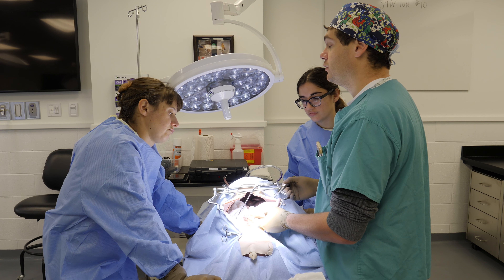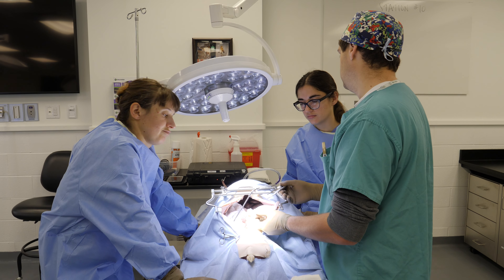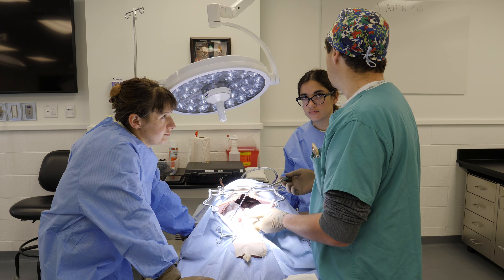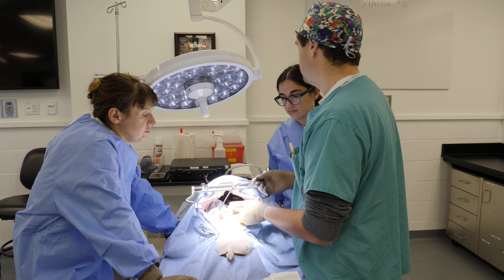Creating an environment for success before you cut the intestine is important, because once you cut it, you're trying to get it back together as soon as you can. So plan, plan, plan — have everything set, then cut the intestine.